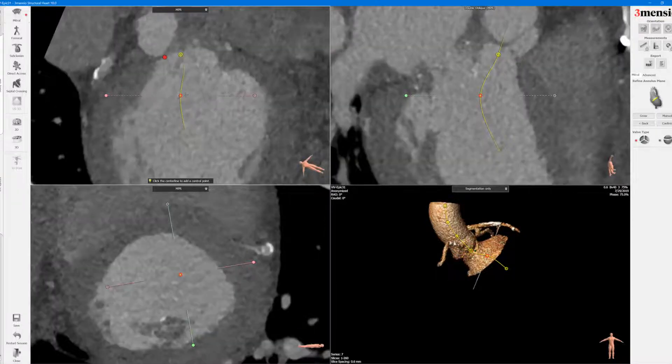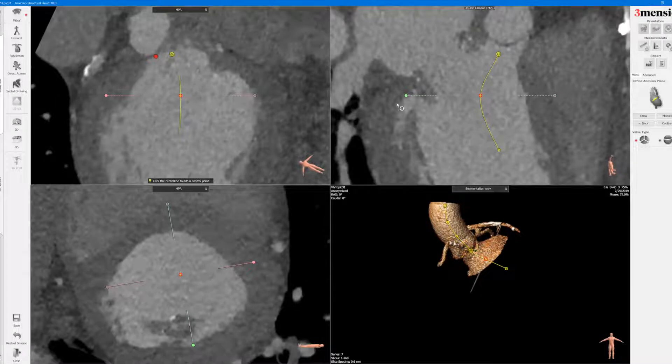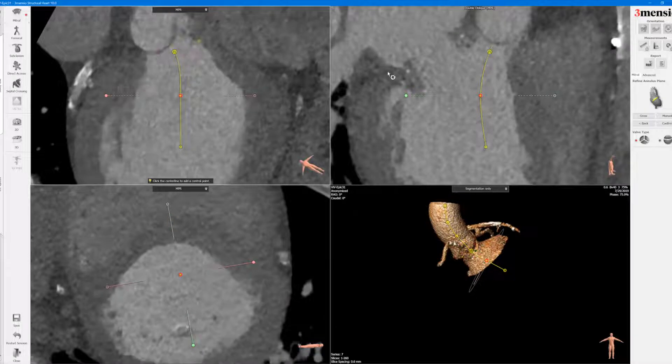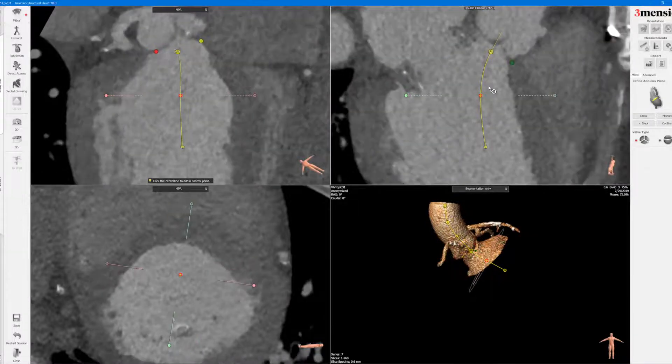It's also important to actually center the LVOT line. You can see this is the prosthetic mitral valve, so you want to actually shift this a little bit more towards the septum while maintaining the center part of the ventricular cavity, so you can see how this traces that way.